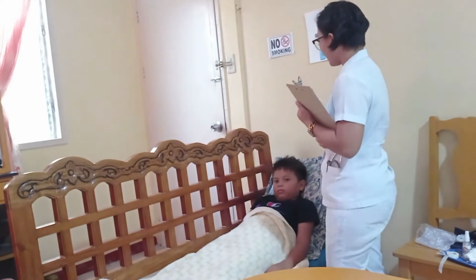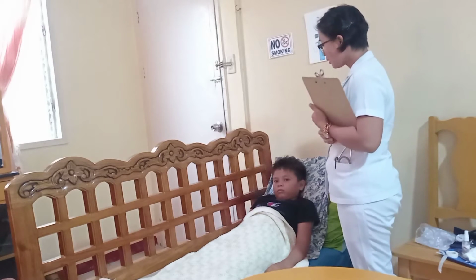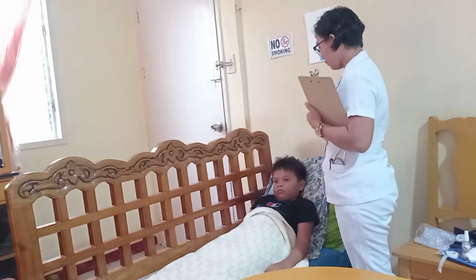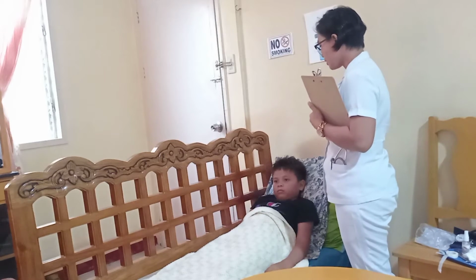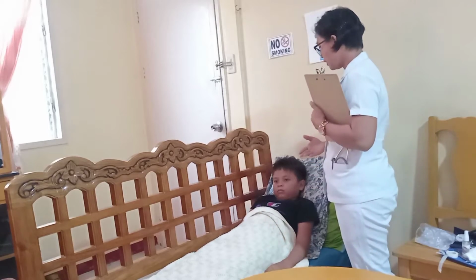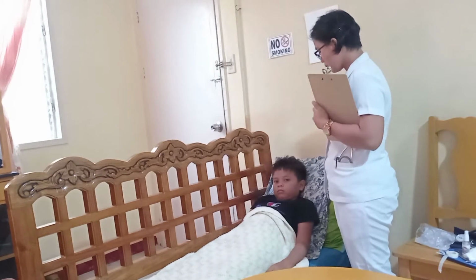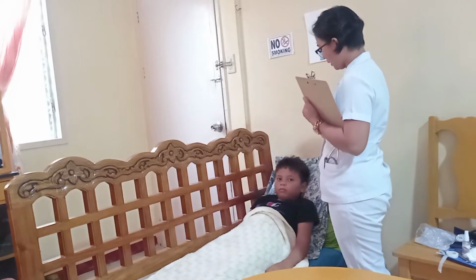Sir, I am going to give you an oxygen therapy. So I would like to first give you some small details about our oxygen therapy. Oxygen therapy provides you the right amount of oxygen, to keep you within your normal limits of respiration, and it will ease you from difficulty breathing to a normal breathing, po.